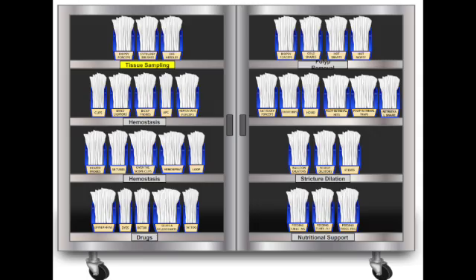How does it work? It's a tube with 2 large inflatable balloons. One sits in the stomach, the gastric balloon. You inflate that first to anchor it, then you inflate the second, longer esophageal balloon. And that puts pressure directly on the bleeding esophageal varices. Massive pressure. It's a temporary, life-saving bridge to buy time for more definitive treatment or transfer. Requires careful monitoring, though. Okay, a critical tool for emergencies.